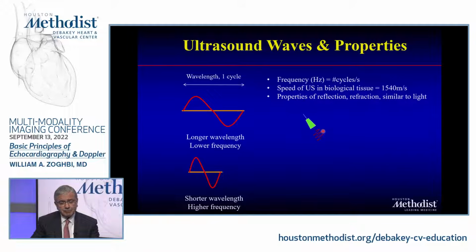And you send bursts of these wavelengths that will hit a certain surface, and the surface for our purposes is the heart and the valves of the heart, etc. When it hits the surface, some of it would be refracted, some of it would be reflected back at an angle, as you know very well.